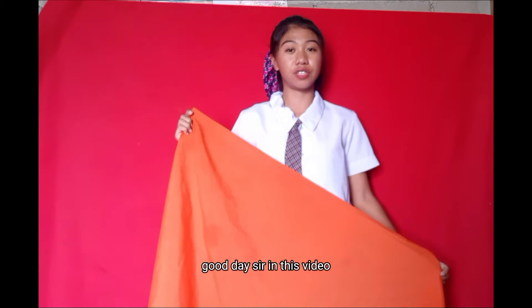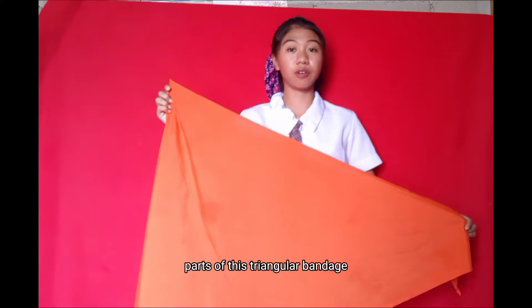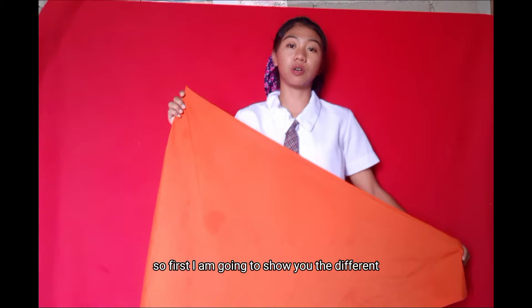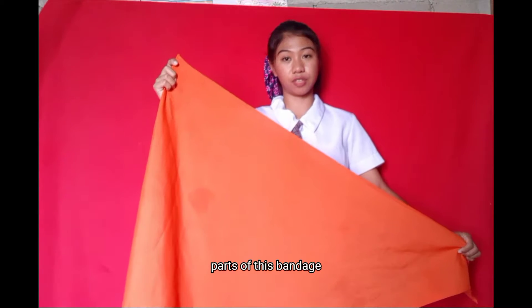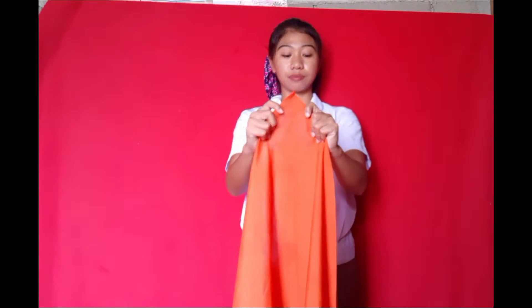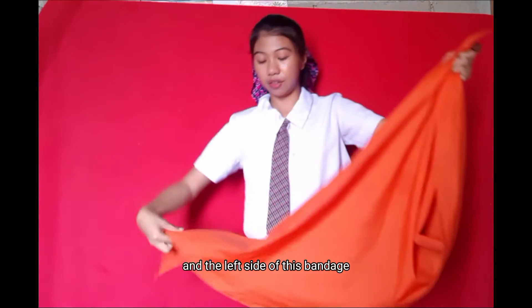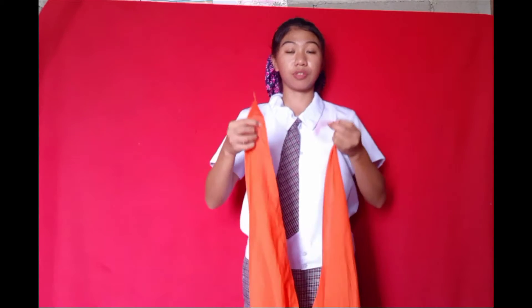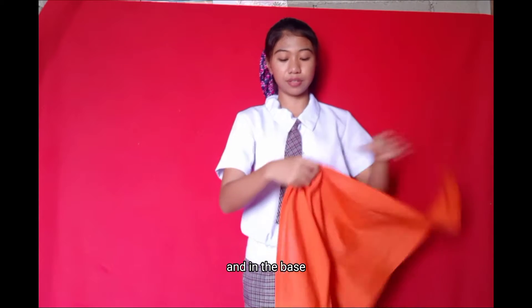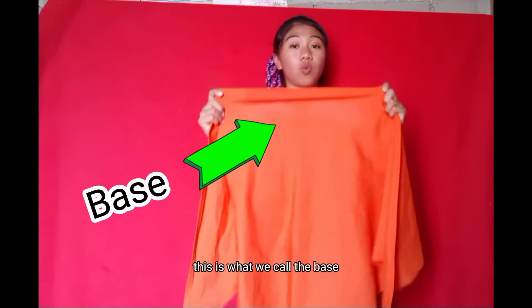Good day. In this video I'm going to discuss the different parts of this triangular bandage and the fold bandaging techniques. First, I'm going to show you the different parts of this bandage. This top part is what we call the apex, and the right side and the left side of this bandage is what we call the ends or the tails, and the base is in the surface — this is what we call the base.